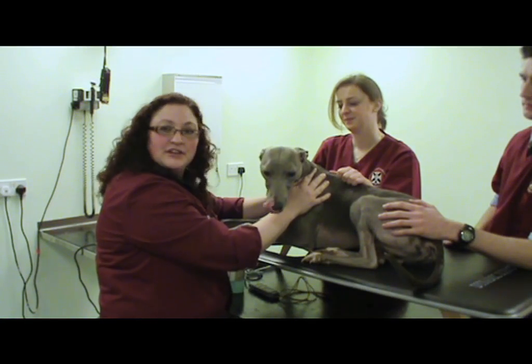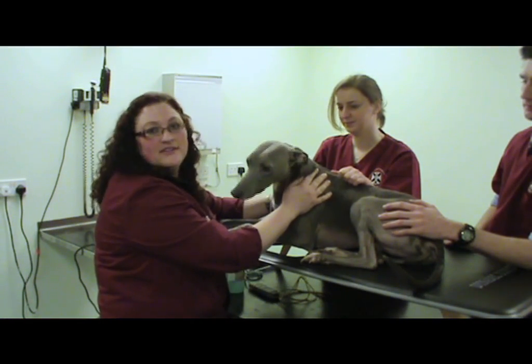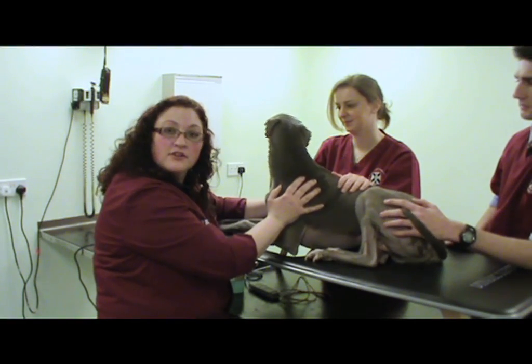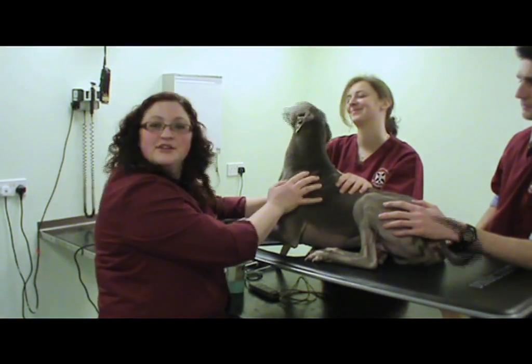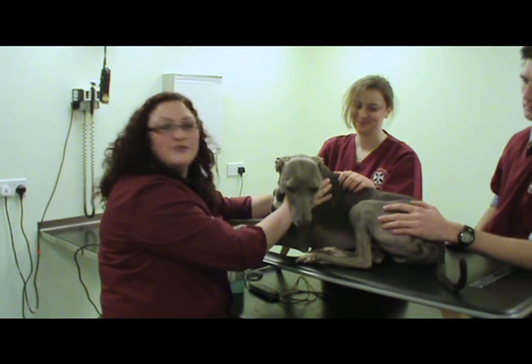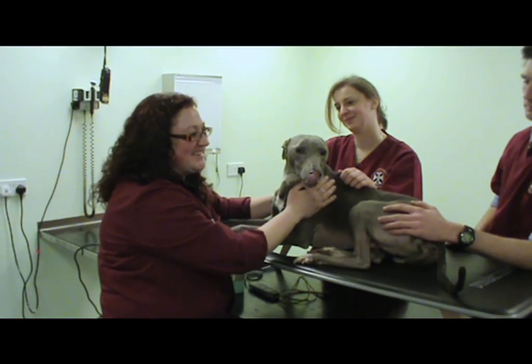In these sets of videos, we've just had a look at how to perform an echocardiographic exam in the general practice setting. We've seen how to obtain the standard views, including the right parasternal long axis views and short axis views, and perform a few measurements that you don't need specialist equipment or cardiac packages for.